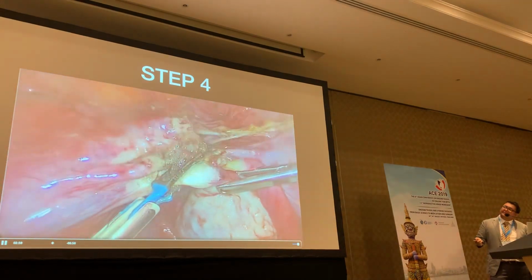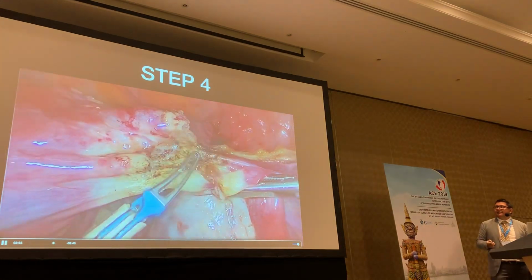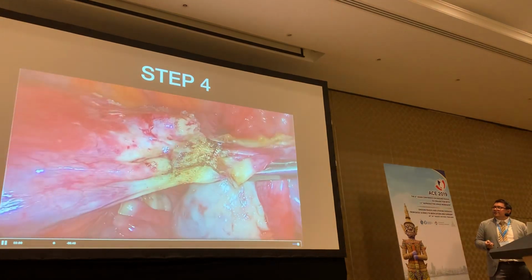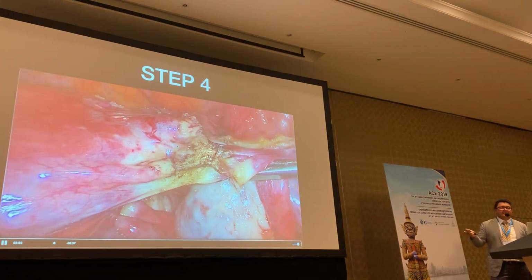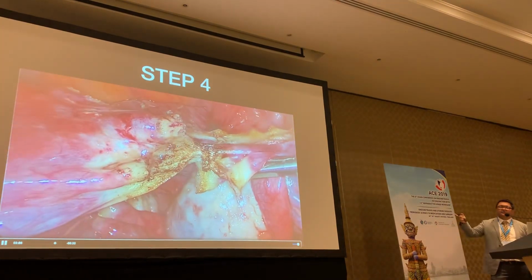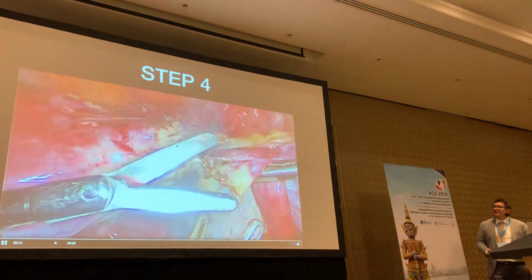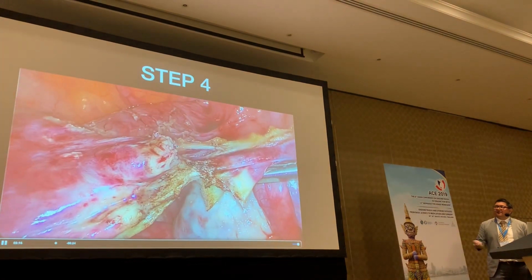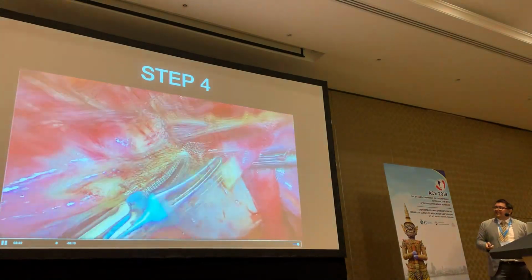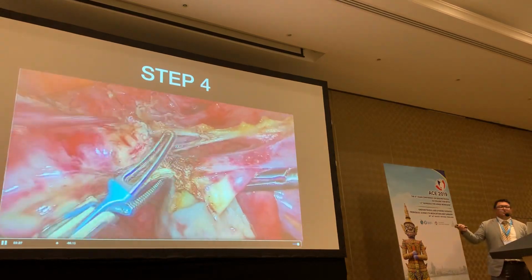And the same thing, I still coagulate close to the uterus, but I will cut closer to the ovary, just to take care of any retrograde bleeding. So now I realize that this is more optimally approachable with my right hand, so I have to alternate here. This is a bit time consuming. Maybe a multifunctional instrument is beneficial here, but it doesn't take that much time. So there's no need to rush through these steps.